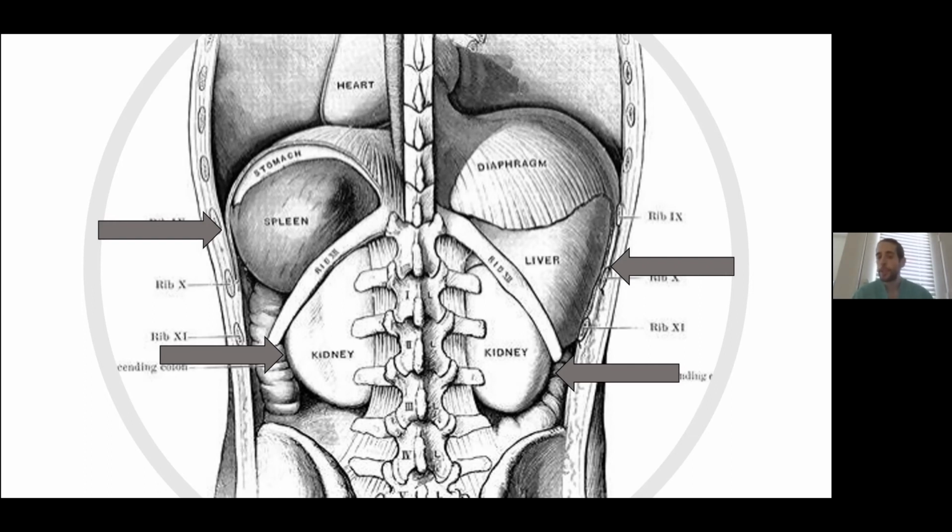There's some question about whether bladder injuries can be seen well with contrast enhanced ultrasound. When they use it for vesicoureteral reflux, they actually do intravesicular boluses of contrast.